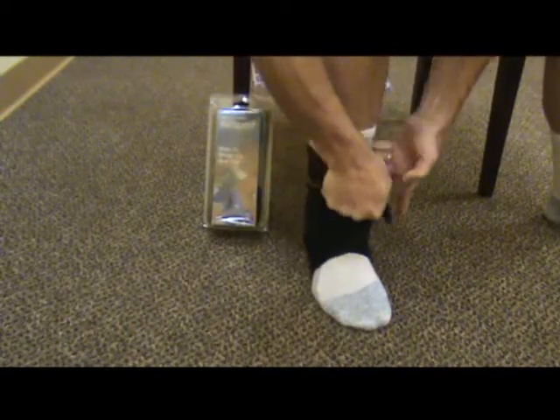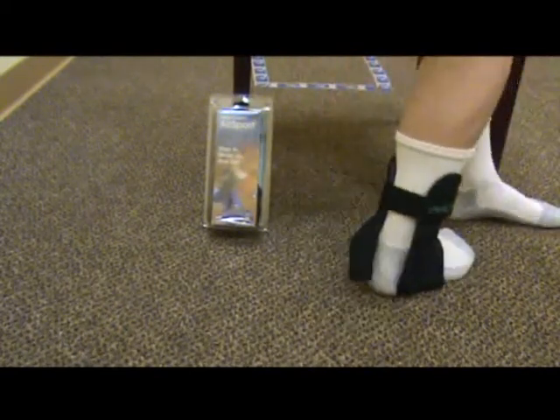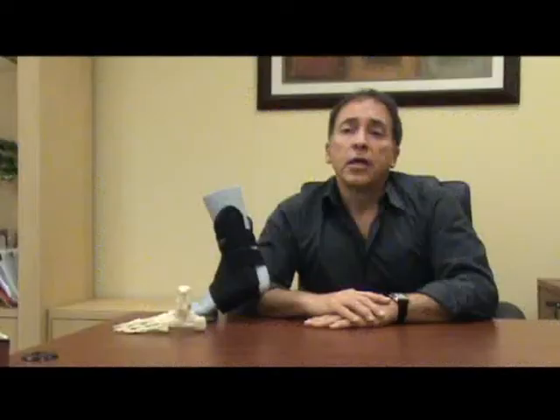A secondary Achilles strap behind the ankle helps bring the two stirrups closer to the heel. Whereas most stirrup braces offer rigid shells on either side of the ankle, the Air Sport incorporates these shells within the fabric of the brace, making it much easier to put on and more comfortable to wear.